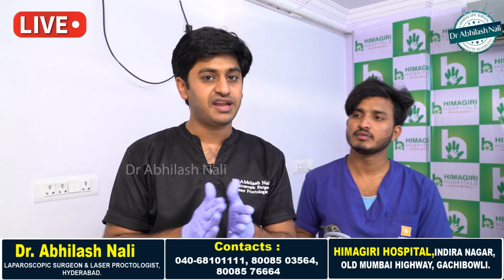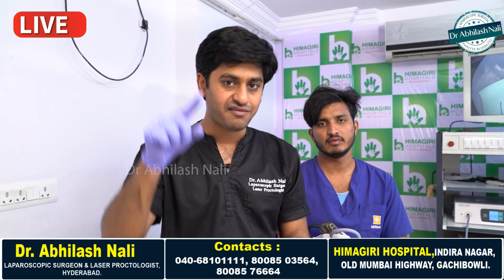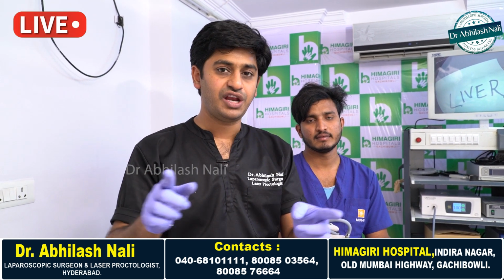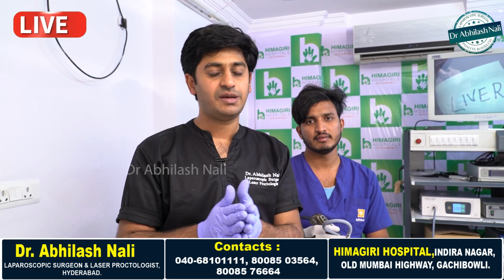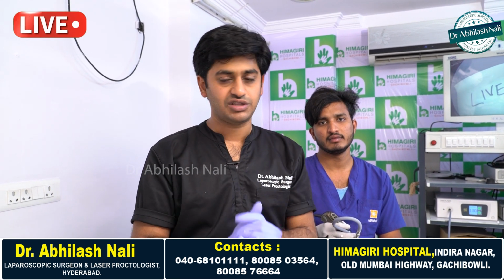So to put it in a nutshell, what are the advantages of laparoscopy unlike open surgery? In laparoscopic surgery, we don't have major cuts. What we have is a 0.5 to 1 centimeter incision. The incision is small, so we need not place any stitches or sutures to close it. We place something called skin glue. It's just like Fevicol for the skin. That is the replacement for the stitches.